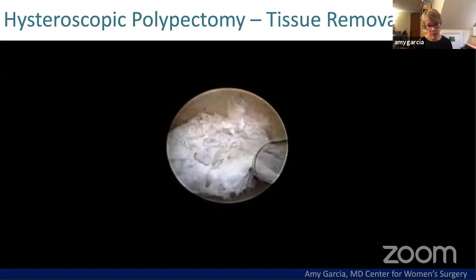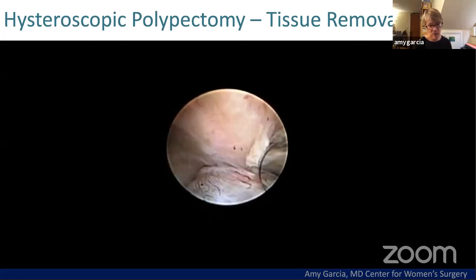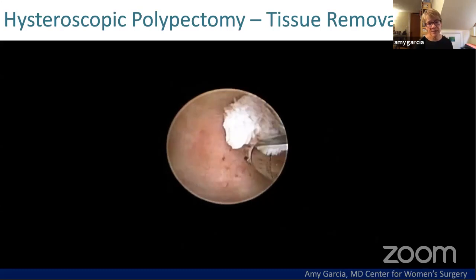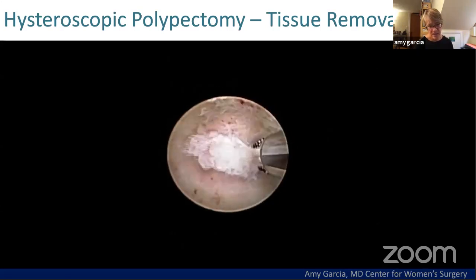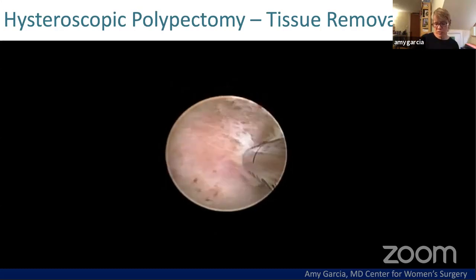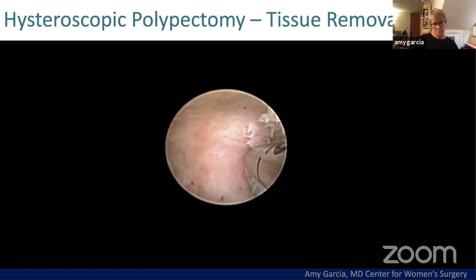There are times when it may be very reasonable to use it, but on an endometrial polyp, it doesn't seem reasonable when I can be very efficient with scissors, using other techniques to get tissues out, and not necessarily having to use these instruments. Most of what you're seeing, the companies are bringing instruments in to allow me to use.